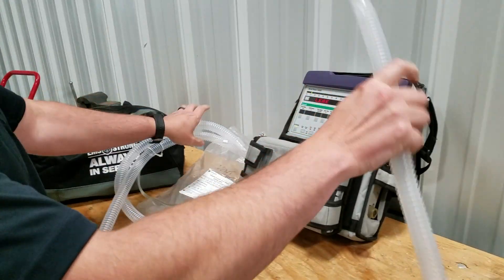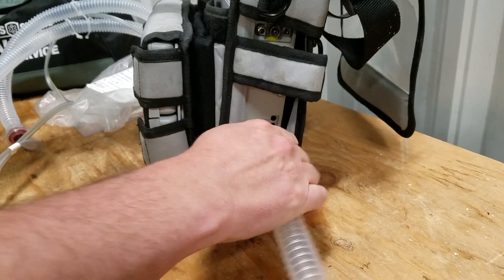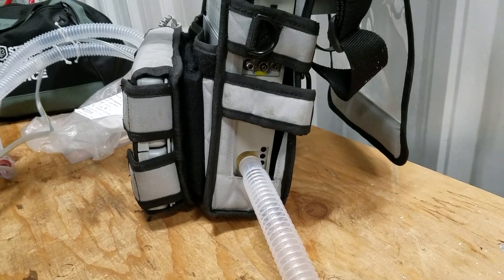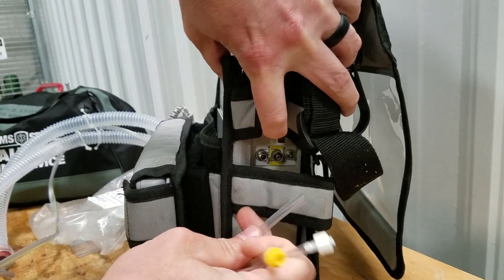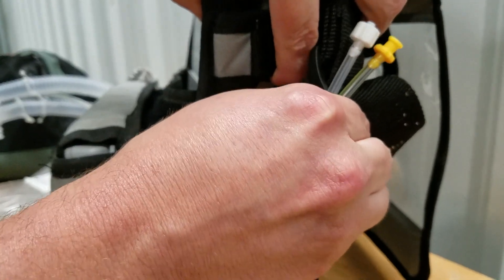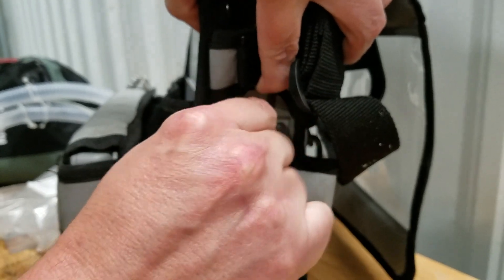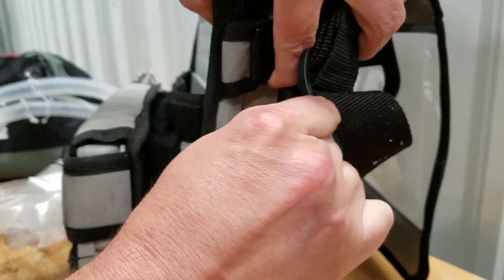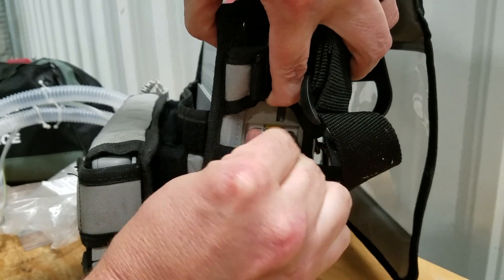We take the tubing and press it on to the side of the vent — we have three hoses to hook up. They're all color-coded so you can't make a mistake. One is a press-on fitting, the next one is the yellow one that goes to the yellow-coordinated port, and the next one goes white to white.